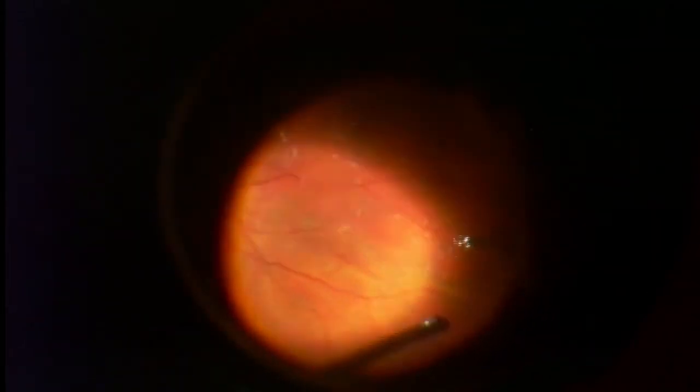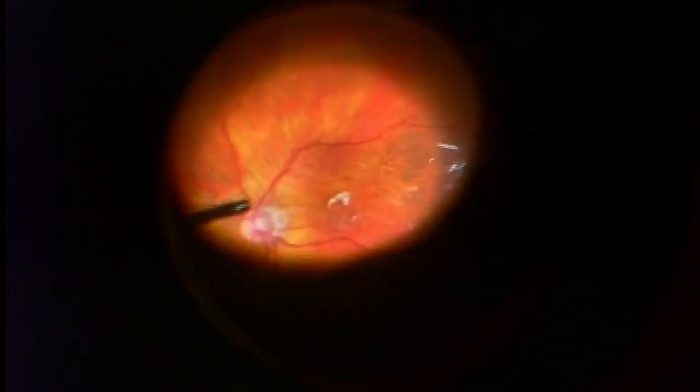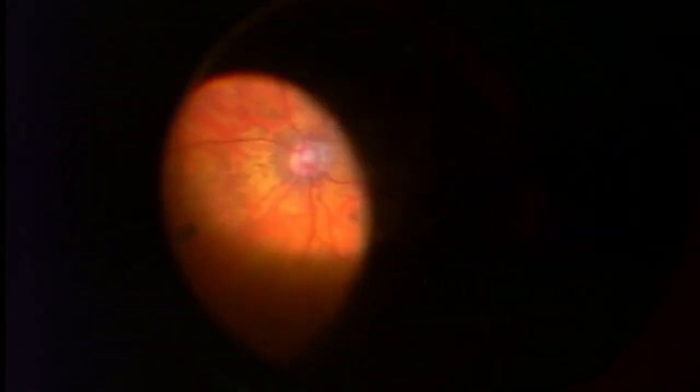So I'm going to go along and remove more vitreous in the peripheral retina, doing so carefully to avoid touching the lens — I certainly want to cause no harm. But we can get very, very far out to the side to make sure that this vitreous is not seen later. I'll go around one or two more times, but you can already see how much clearer the vitreous cavity is, either compared to the asteroid or compared to when I injected Kenalog.